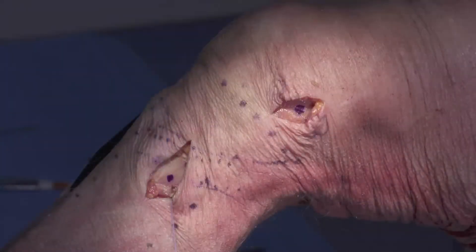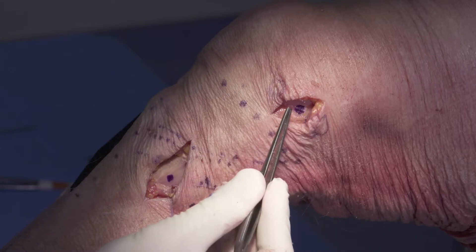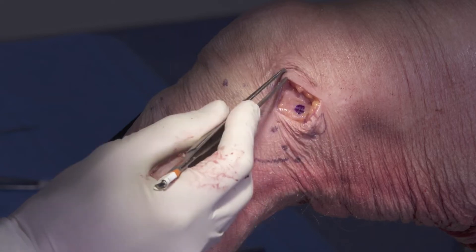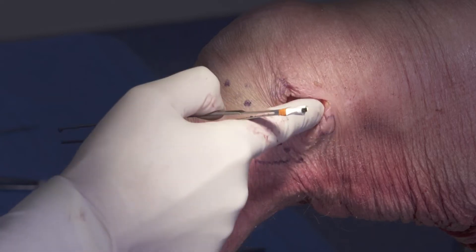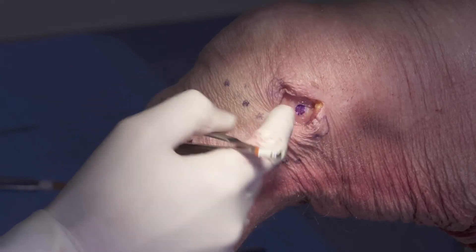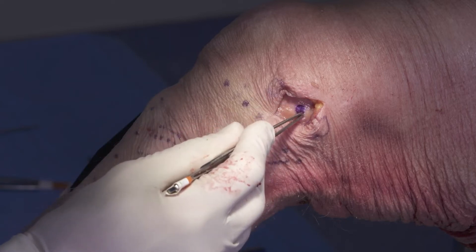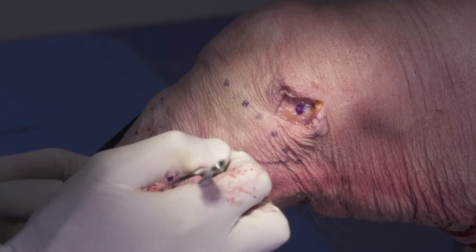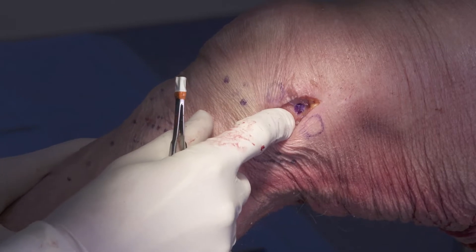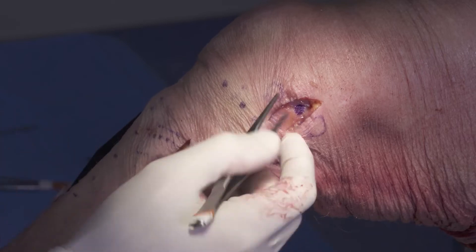We've gone ahead and made our dissection starting on the femoral side. We made approximately a one inch incision centered directly over our superficial landmark and elevated off skin flaps anteriorly and posteriorly. We can directly palpate our adductor tubercle as well as our medial epicondyle, and we'll find our superficial MCL origin proximal and posterior to that medial epicondyle. I can also confirm location by applying a slight valgus load and feeling the injured MCL tension under valgus, which can help us identify our femoral sided origin.